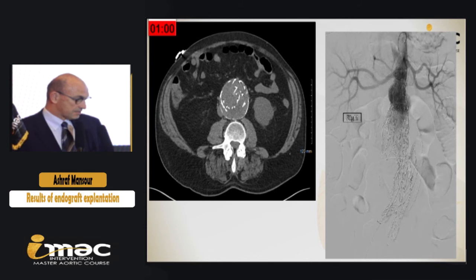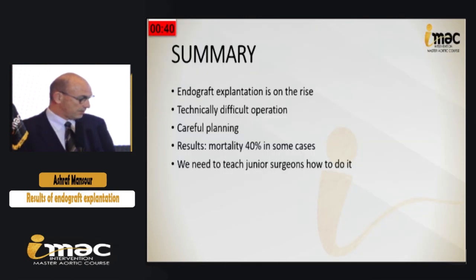I show this case just because this was an Endologix case. One of my partners had done it, type 3 endoleak, and I spent about half an hour trying to get back into the scrunched limb, and the final result here shows that we were able to avoid an explantation, but I kind of wonder at night how long is that going to be good for.